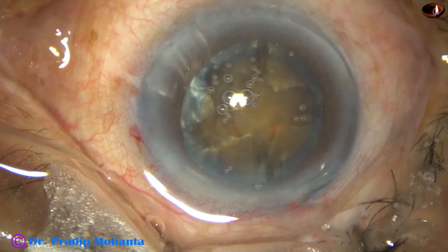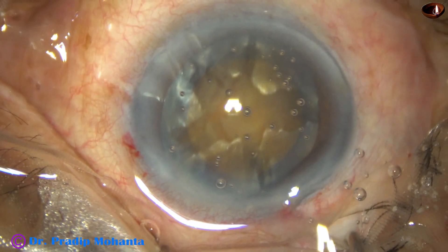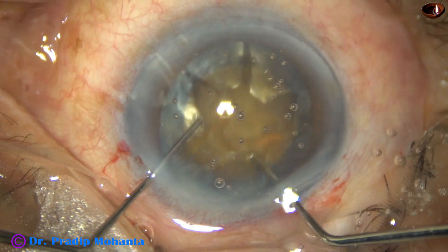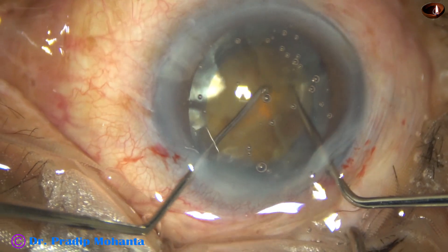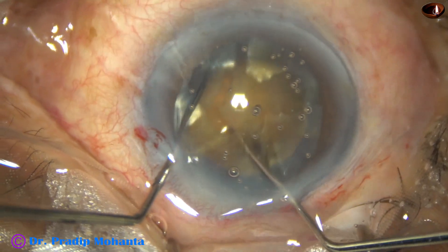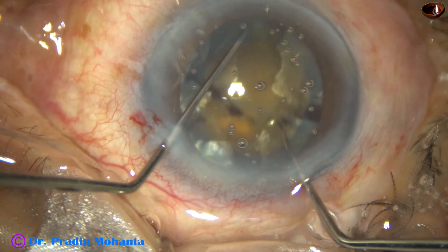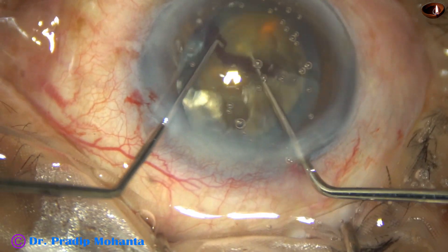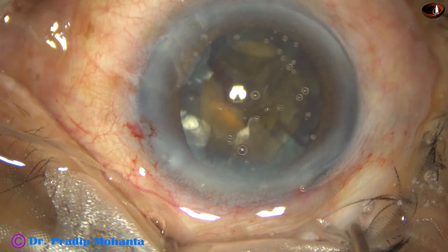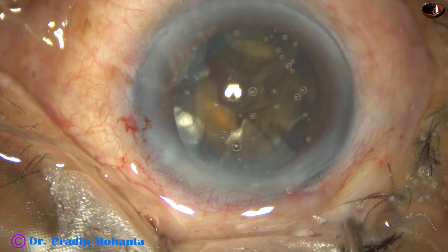Then I come out and inject visco. Now with the help of two Shinsky hooks, I am trying to separate the pieces. And here I could separate two hemi-nuclei. I tilt one hemi-nucleus and I could tear off the bond between the two pieces.